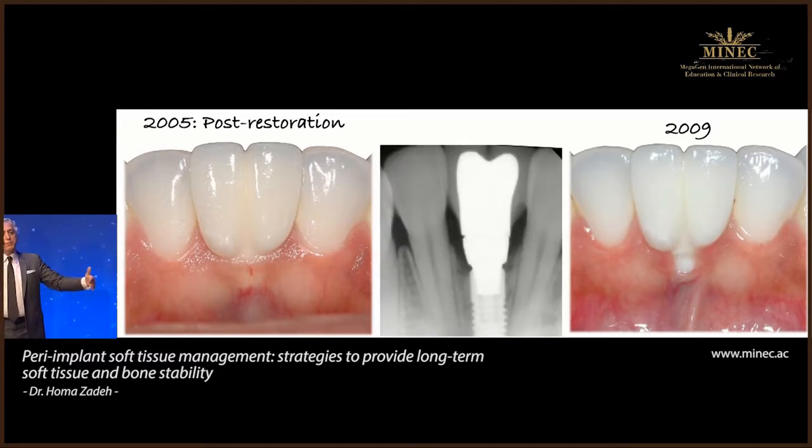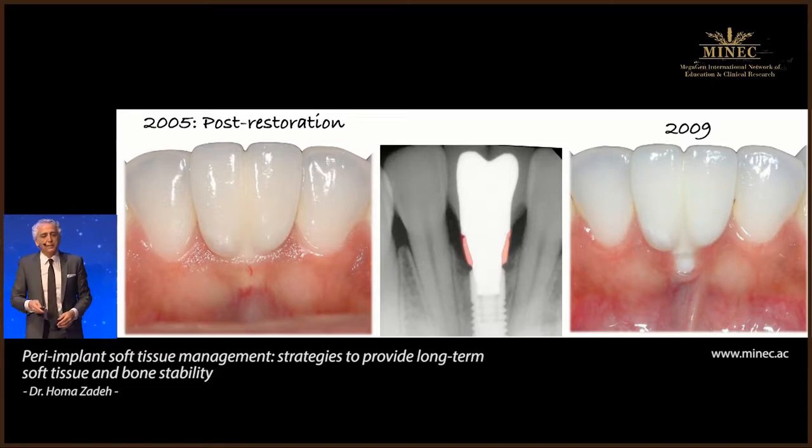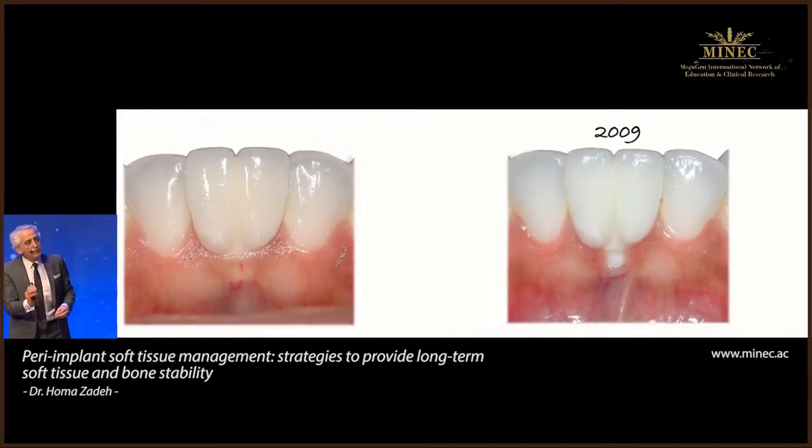And when we look at the design of the restoration, we could see that the abutment was very, very wide. So the more space in the transmucosal portion that's taken up by the restorative contour, the less space there is for the mucosa. So the ideal situation is to have kind of like a trumpet-shaped concavity of the contour so that the mucosa will be thicker in this area.